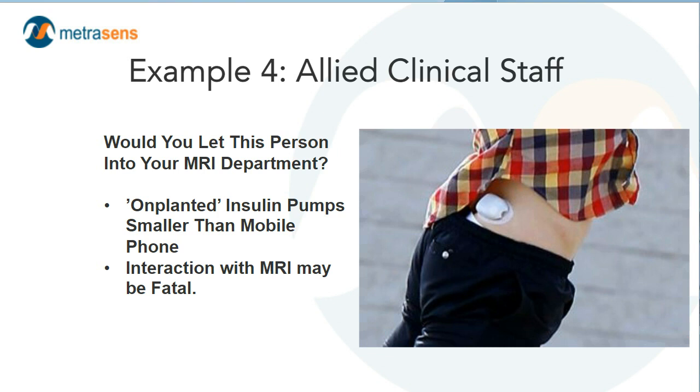And if your screening protocol is empty your pockets and I'm just going to check you out, doctor, because you walk in, you're a doctor, and I'm not going to go through the full screening process. Maybe I recognize a stethoscope around your neck, or hemostats or a laryngoscope in your jacket pocket, but you may not recognize that there is a little patch on their back or their abdomen that is a drug delivery system that may interact badly with the MRI.